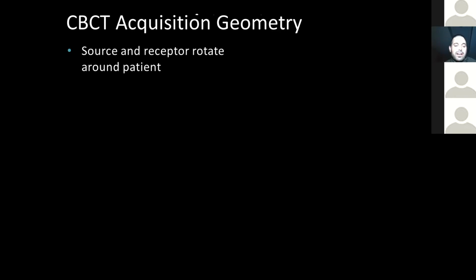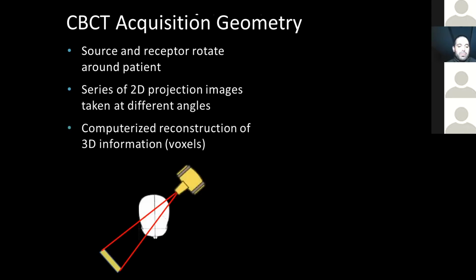Very good. Let's talk about the cone beam CT first, and I'm going to apologize now. We'll do a little bit of physics, but I will do my very best to make all the physics I cover clinically relevant. I'm first going to talk about what the machine is actually doing and how it's getting the information. I'm going to jump through a bunch of points here and get to my skull.